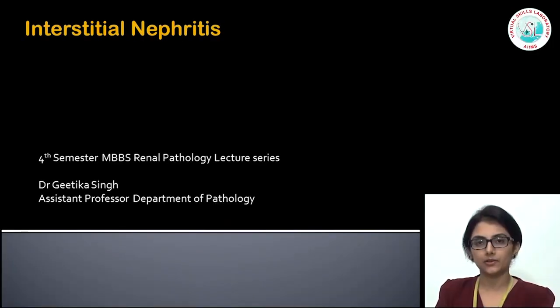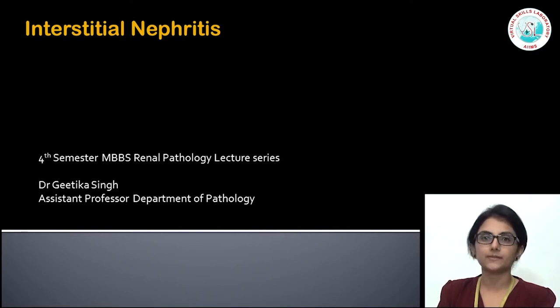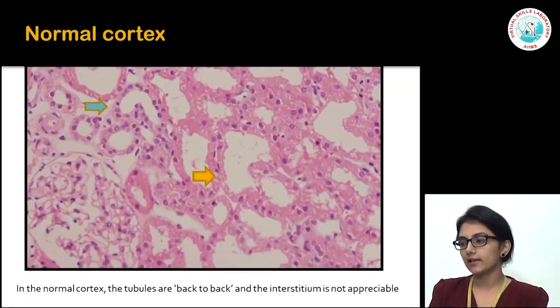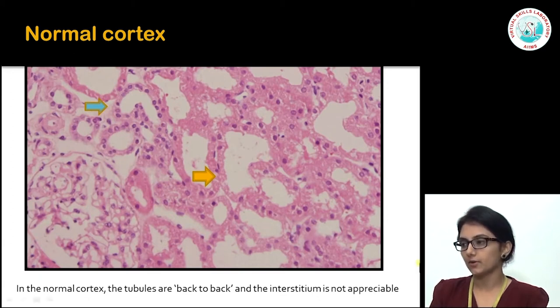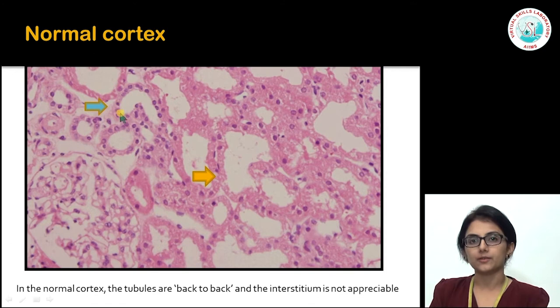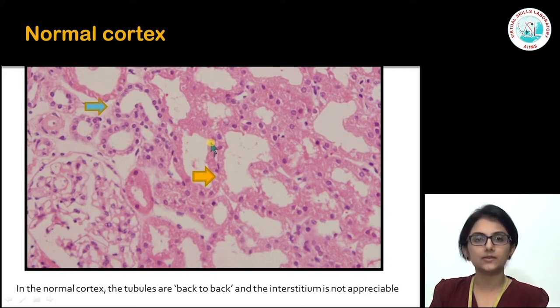Welcome to the series in renal pathology. Today we are going to be talking about interstitial nephritis. Looking at the first slide, we can see what the normal kidney looks like. The yellow arrow points to the proximal convoluted tubule with its abundant eosinophilic cytoplasm, the distal convoluted tubule with more cuboidal lining cells, more packed nuclei and less cytoplasm. The interstitium is really just a potential space between these tubules.